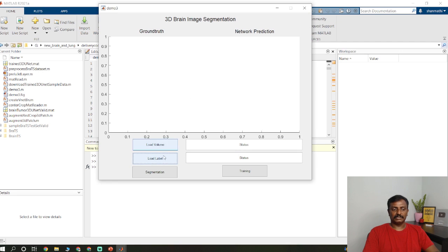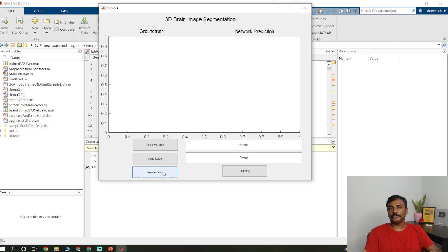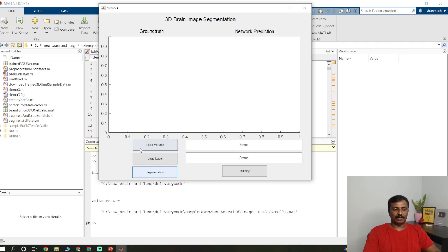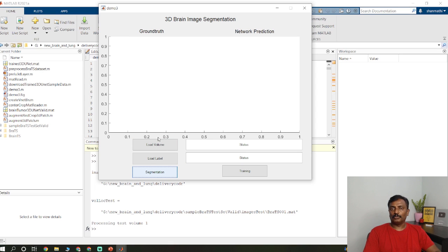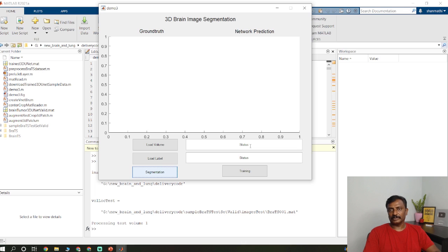And click segmentation. It will take some time. It is better to run this program on a GPU-based laptop. Click segmentation and you have to wait. So the output will be displayed on this static text. Accuracy will be displayed here on the status.